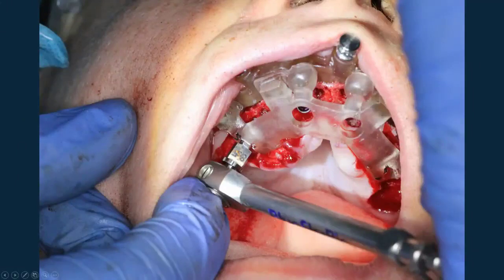And so here's the implants going in, and one of the things we found was she had super, super soft bone. If I'm going by memory, I believe we only had a 3.0 osteotomy and ended up with 5mm implants and still couldn't get primary fixation. Okay, so we still guided them in, still got the positions right.